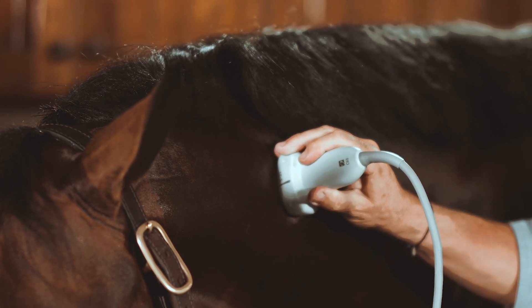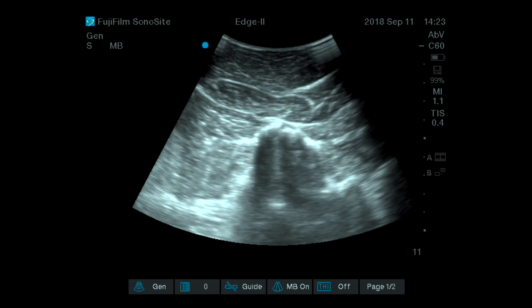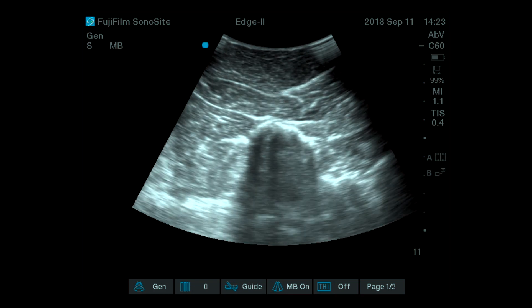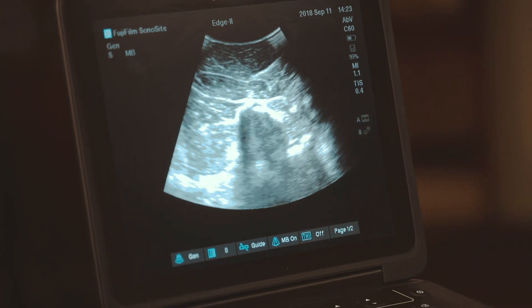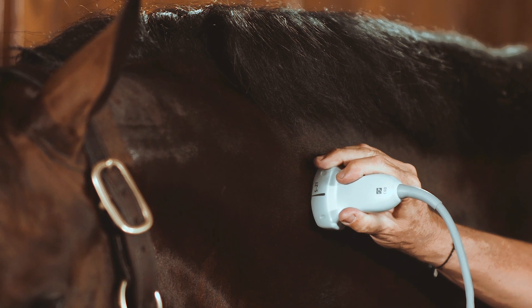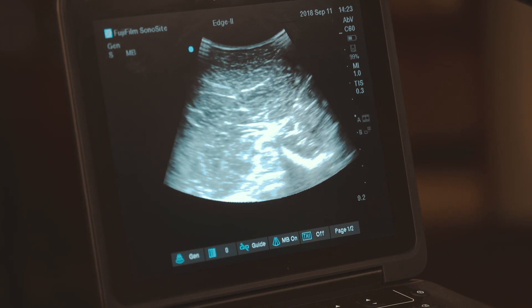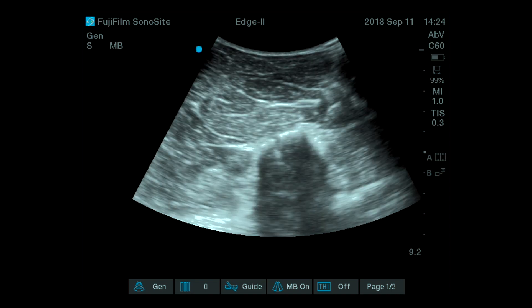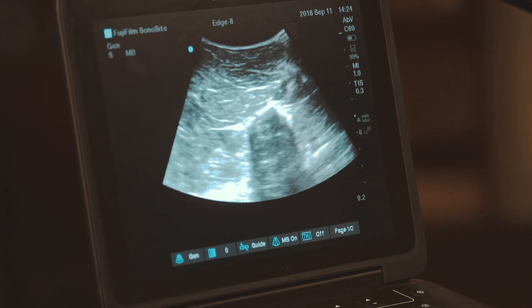As I go down, I move caudally to see the joint space at the level of C3-C4, and we have the same type of view with some echogenicity giving us the margin of the joint space. Moving more caudally again, we see the ridge of the vertebra and the transverse processes, and then one more facet joint — this is C4-C5. Again, you have a small gap on top which gives you an idea of where the joint space will be.